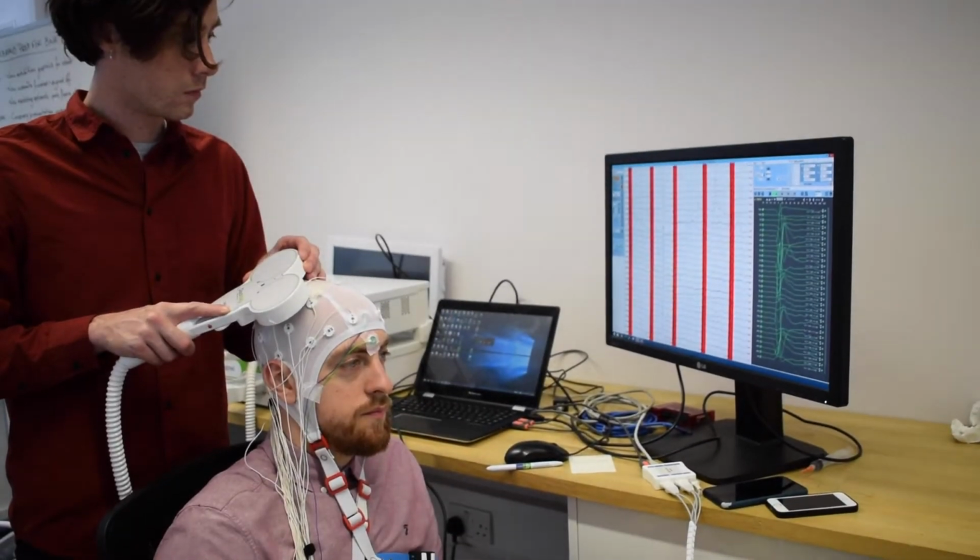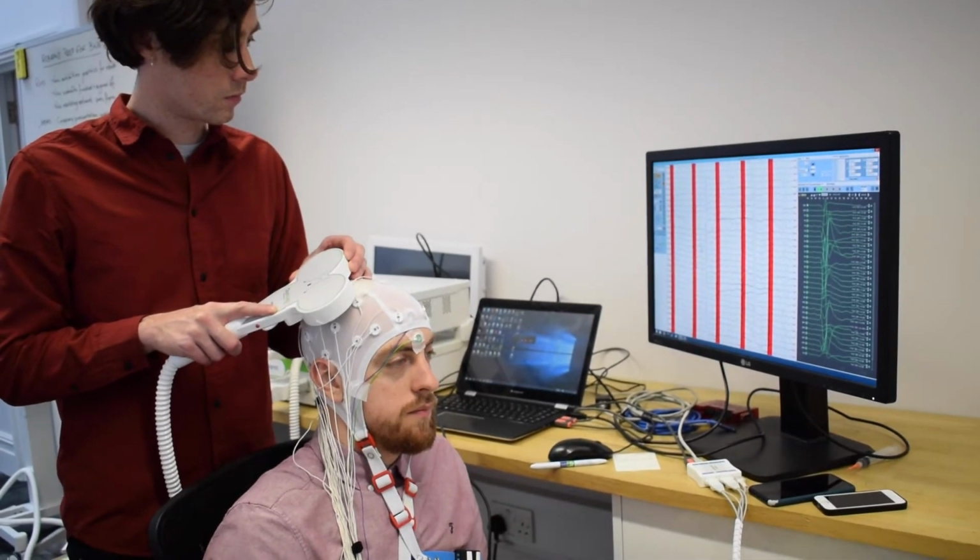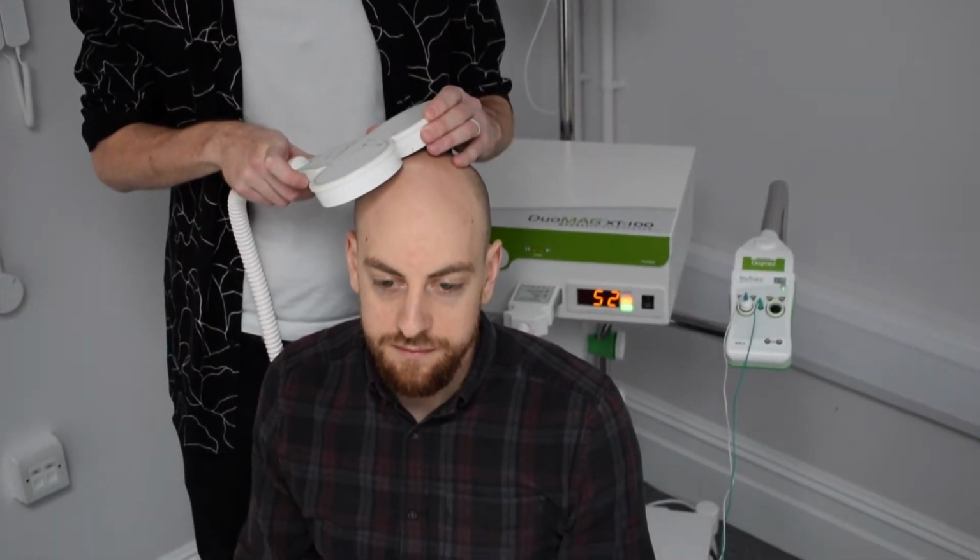Hello, and welcome to this Brainbox how-to video for the DuoMAG XT system, focusing on its features to measure and set resting or active motor thresholds.